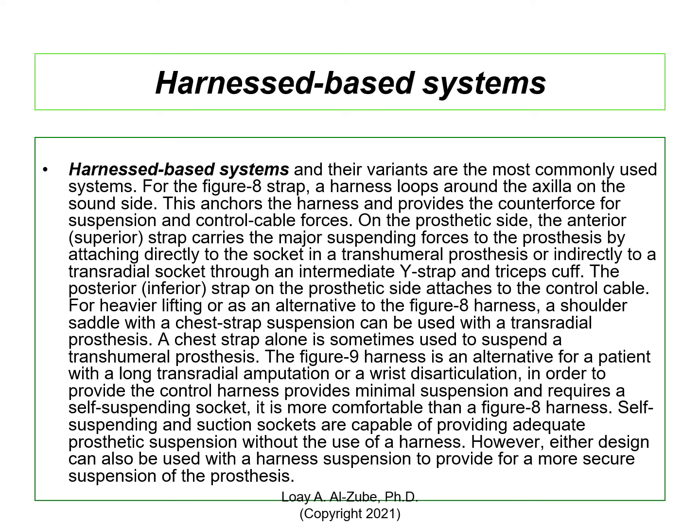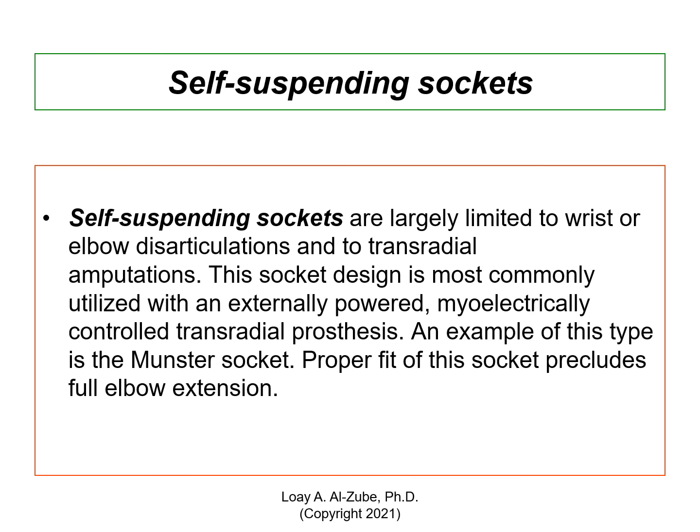You can go through this, but it's good information to learn about, especially the Y strap and the different types of straps, if we would like to build something like that. But I would like to focus on the electrically powered prosthesis. That's what I want to be focusing on.